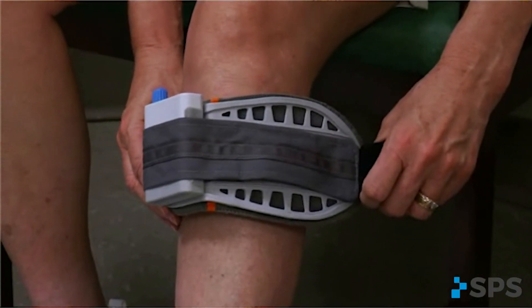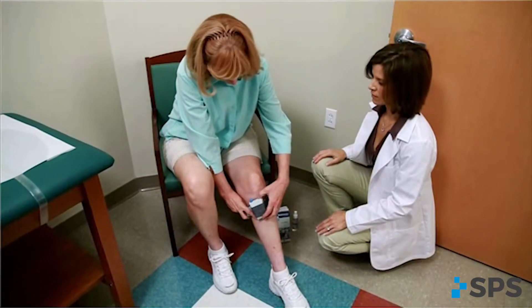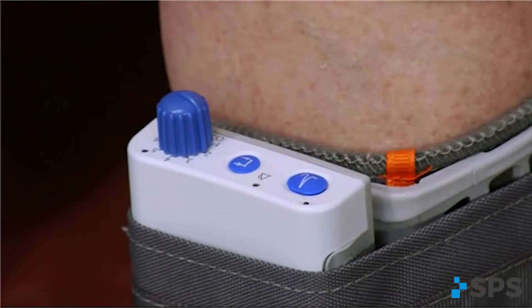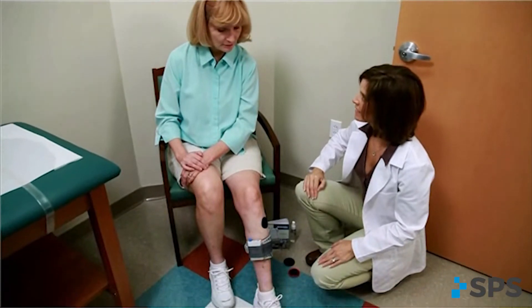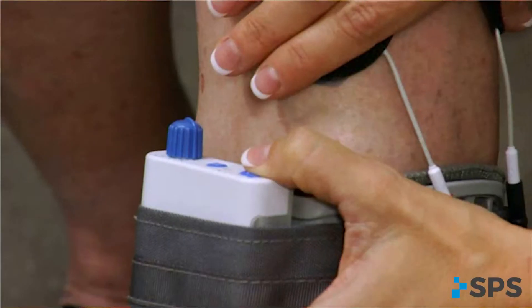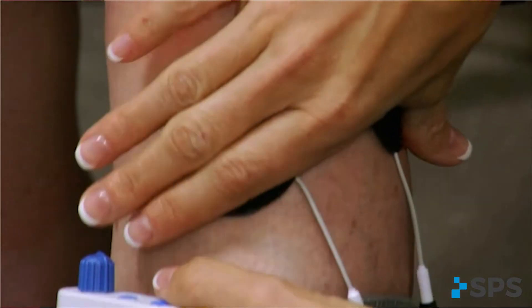Keeping the electrodes clean and covered when not in use maintains their integrity. The lowest intensity possible should be used to clear the toes from the floor. Review the patient's wearing schedule and identify overuse, as this could lead to skin discomfort or overuse injuries. Adjust electrode placement to promote comfort and function, and decrease pulse width and/or time between stimulations to enhance comfort.